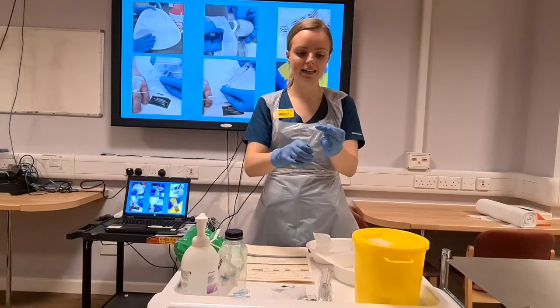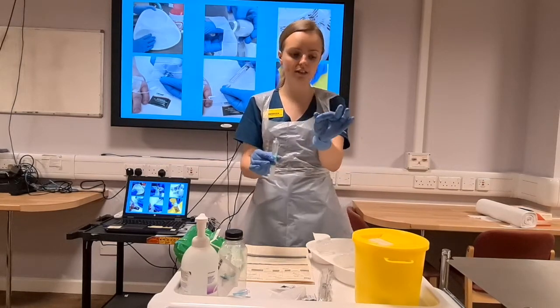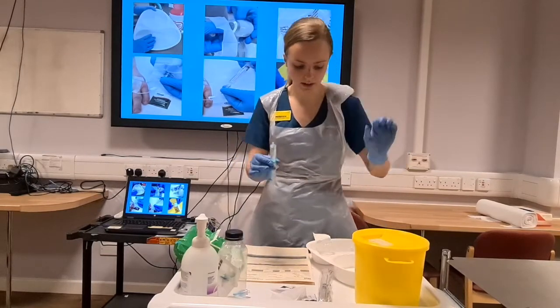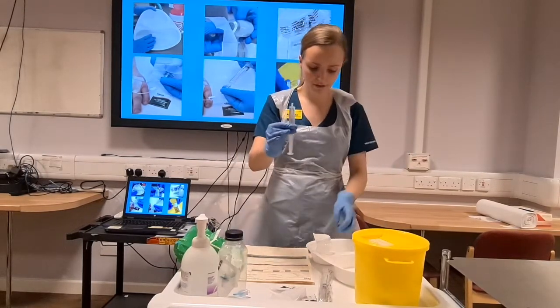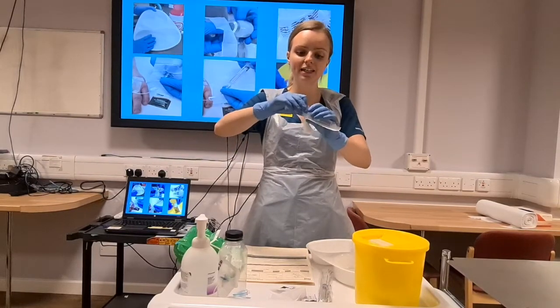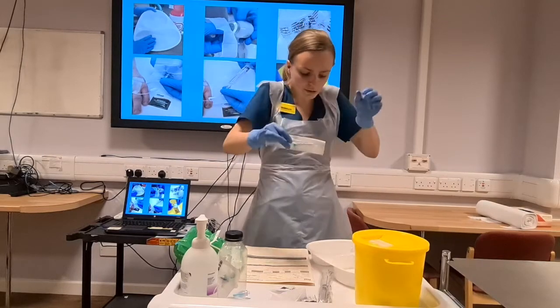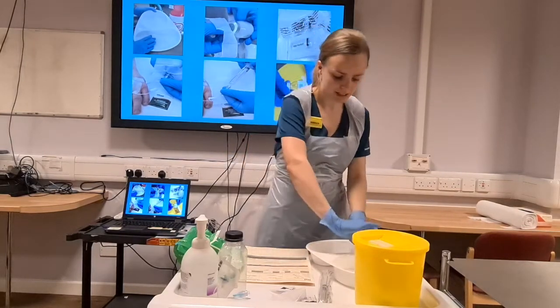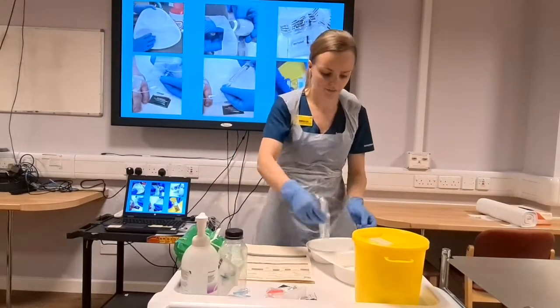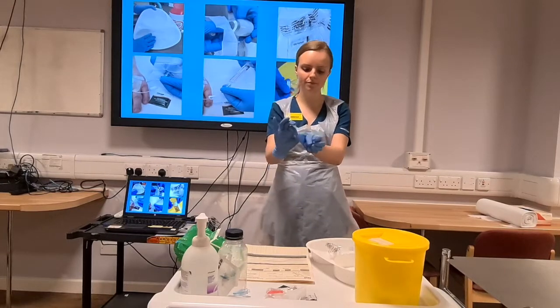That's it. And at this point, I'm not going to resheath. Absolutely no reason for me to resheath. So this is going straight into the sharps bin, like so. Again, remembering to protect my key part, and I'm going to put it back into the packaging because the packaging was sterile, and it's in its nice little sleeping bag, nice protected. I'm going to remove my excess rubbish. I'm going to get my flush, and now I'm going to remove my gloves and apron.